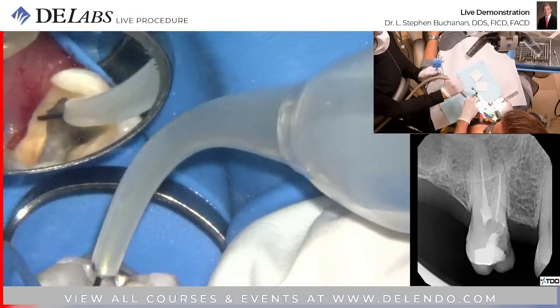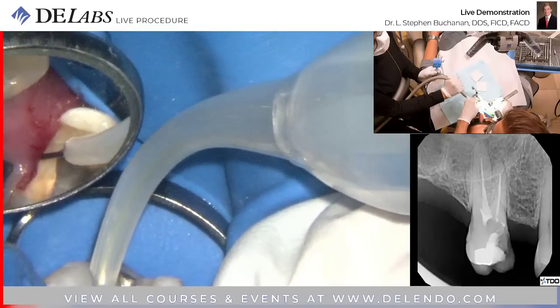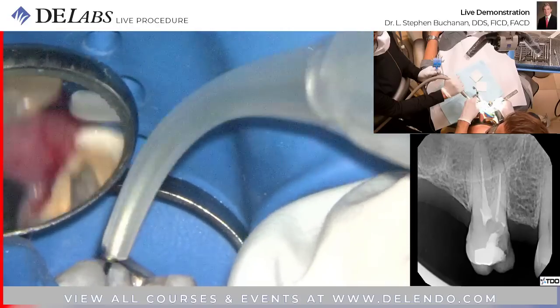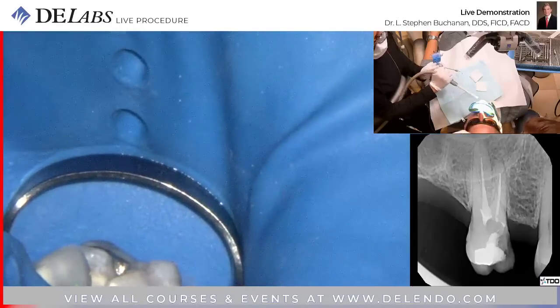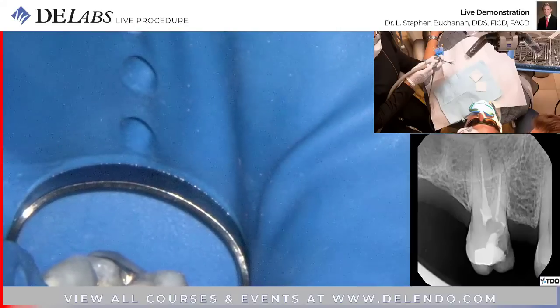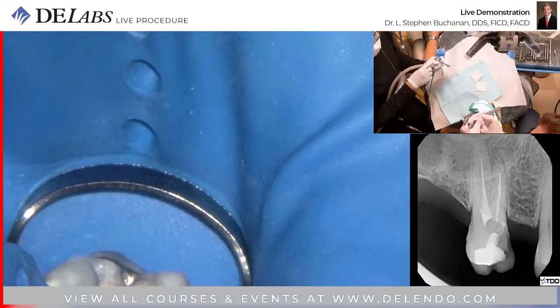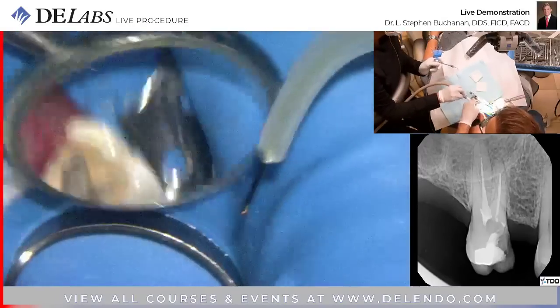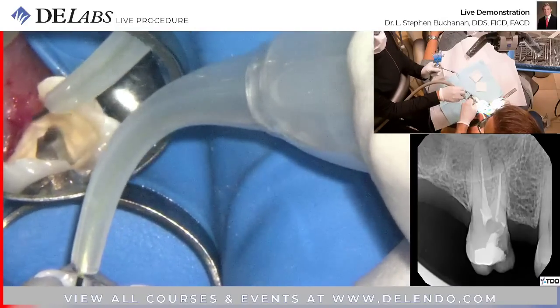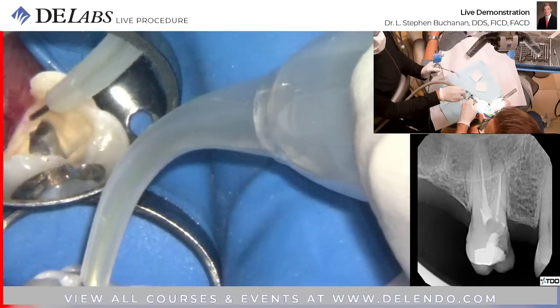Okay, let's see if this thing is, there we go. Now diode laser is basically just heating it. Heat cautery is really effective. I think we need to, is it initialized? Oh, I don't have it turned up. I use it at full 2 watts of power. And it really just kind of shrinks the tissue.